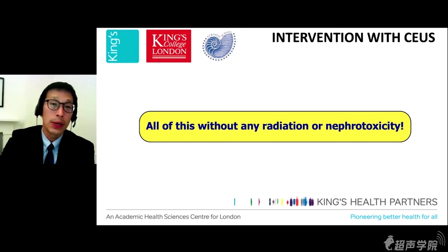So overall, in my practice, and I hope in your practice too, contrast enhanced ultrasound can add a tailor-made solution to a complex medical or logistic problem that you may face in your medical practice.